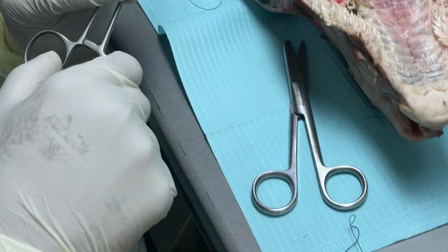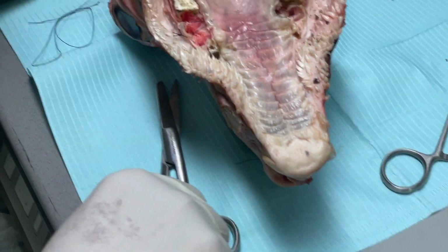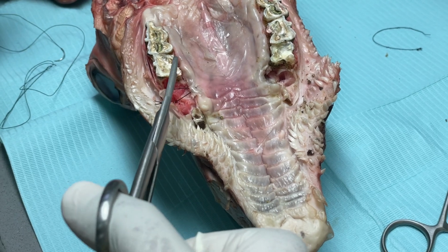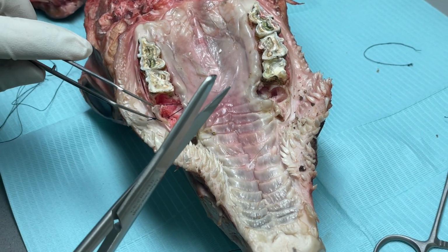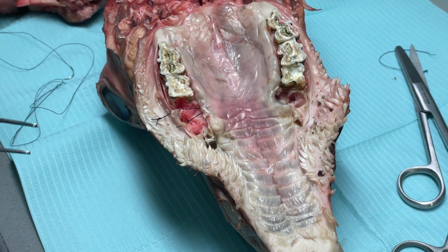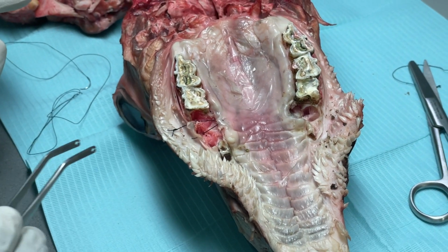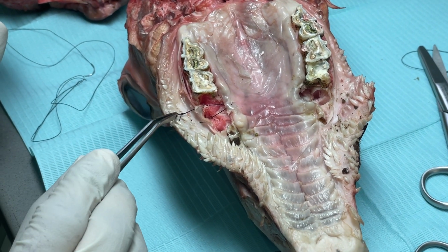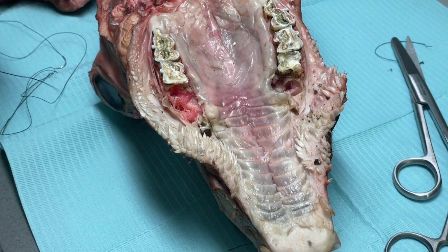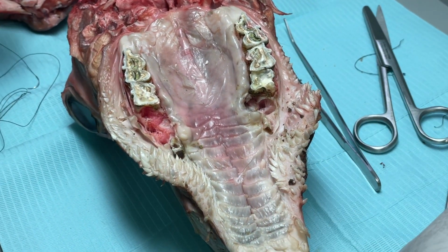But Doctor, on the figure of 8, if we want to remove all the suture after 1 week, from where do we cut? Near the knot only? Yeah, near the knot. For example, consider this is a figure of 8. You don't have to cut here and here and here, just one point. I will cut it here. But what I should remember, after I cut it, I have to see where is the knot. The knot is here, so I should not try to pull it out from here, because this will get stuck and you will pull hard. Hold the knot and pull it out. Simple. Clear? So that was the horizontal mattress.